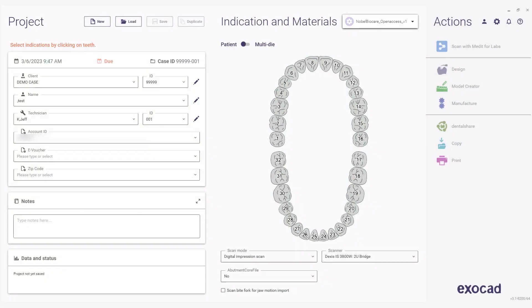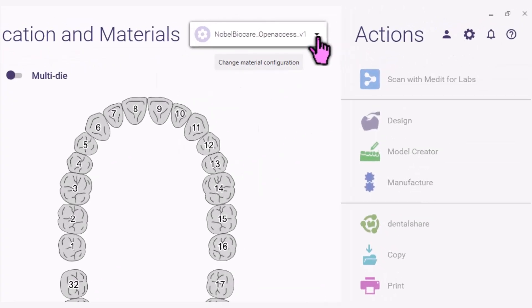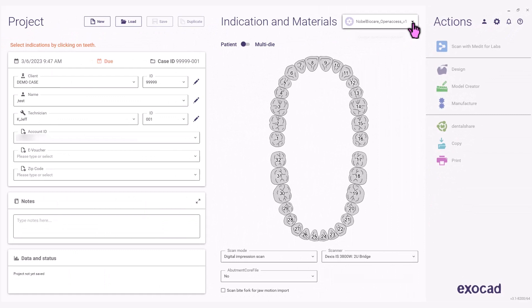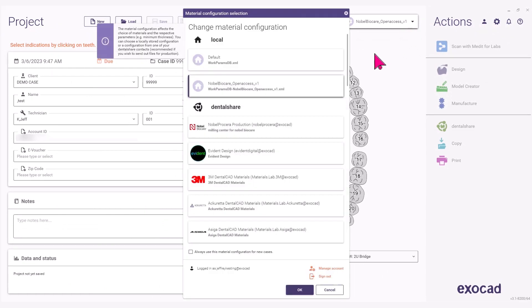After all files have been downloaded and installed, click on the down arrow on the top right under Indications and Materials. Select Noble Procera Production — Noble Procera at ExoCAD under Dental Share.